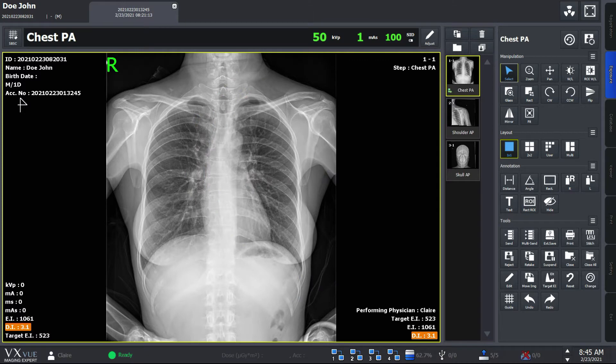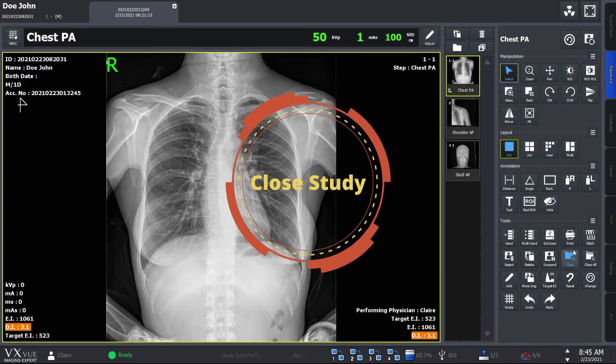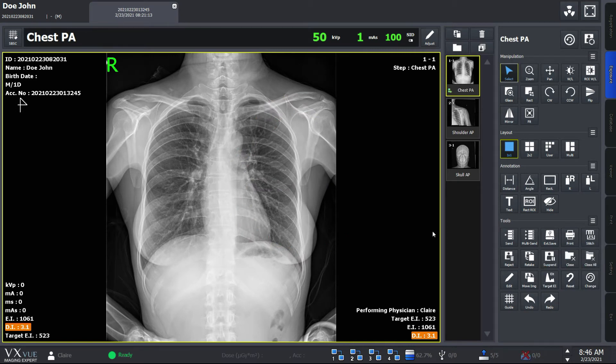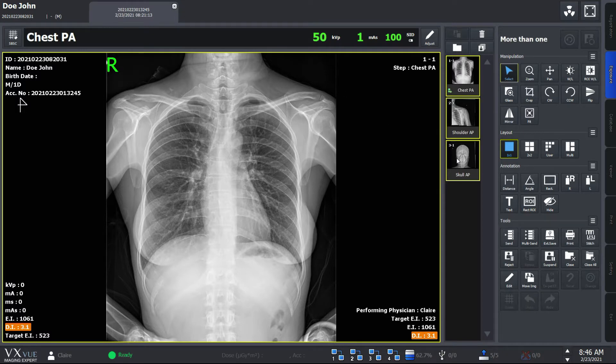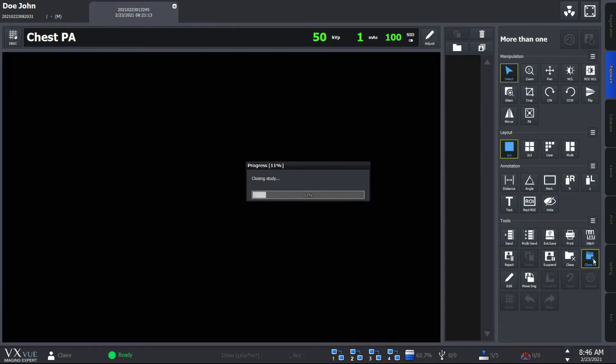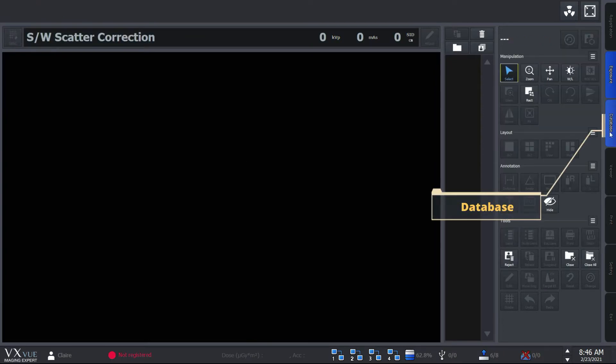When you're done working with your x-ray images, you can close and save your studies using these icons. The close button allows you to close one study, and you can also do this by clicking here. VXView also allows you to close more than one study at the same time. The closed studies are stored at the database mode.